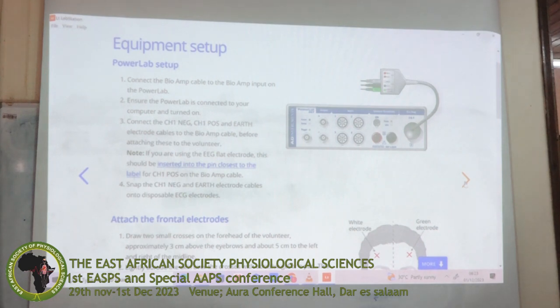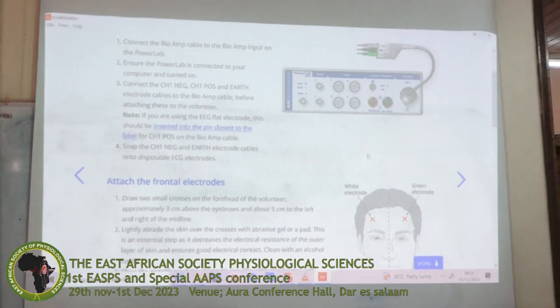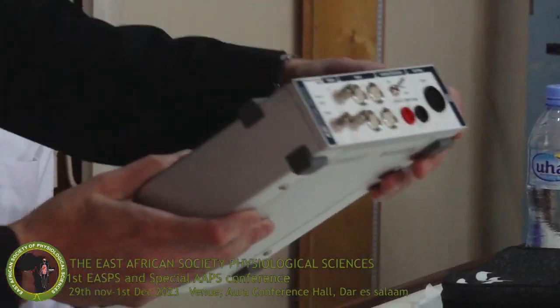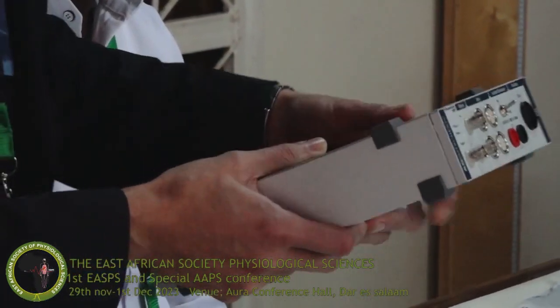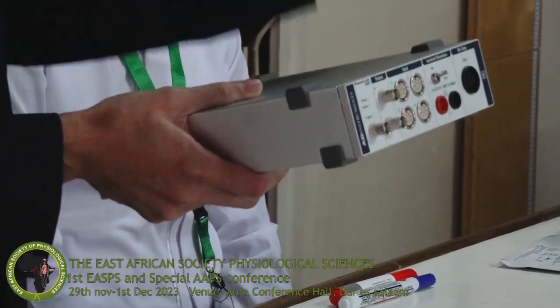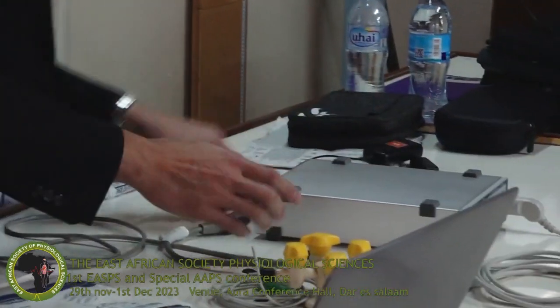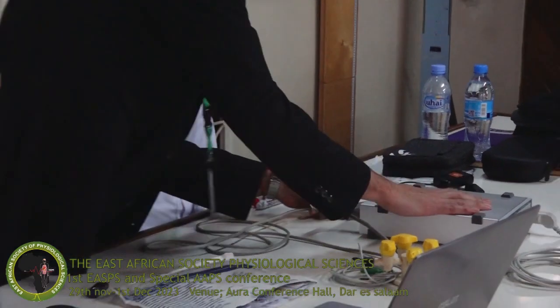Okay. So the first part, in this case, you will need to connect the bioamplifier. This unit comes with 4 channel acquisition ports and a stimulator that is safe to be connected for students, unless you really want to wake them up, but nothing will happen. Then we have the bioamplifier, which is one of the key components, because it opens the possibility not just to use the EEG, but also to do EMG, ECG, and other detections. All right, so we plug the unit, connect the power supply, and data sync via the USB cable.